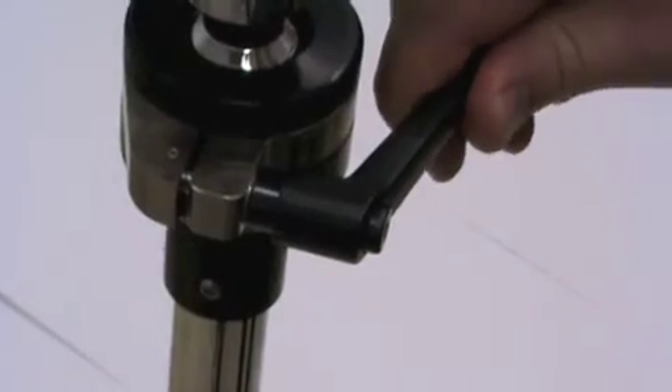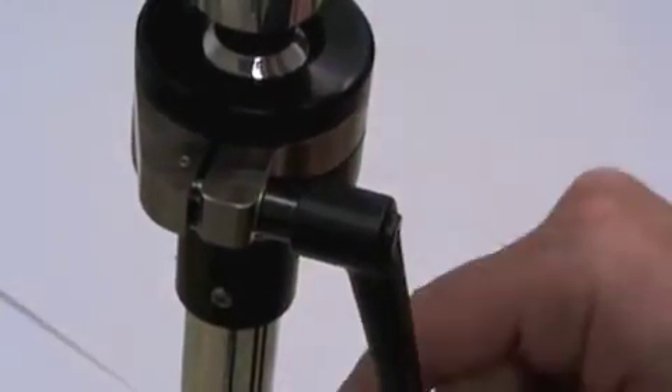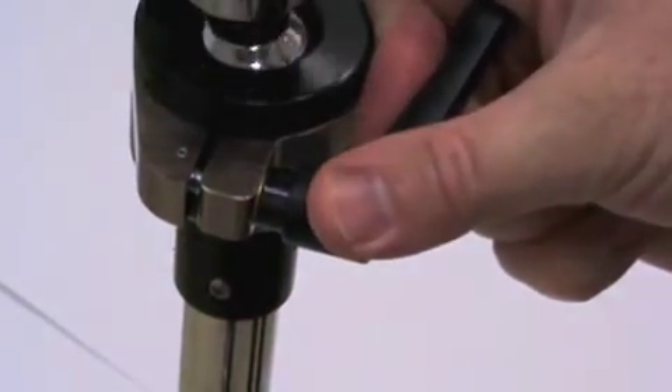To reposition the handle, pull it out, adjust it, let it snap back into place, and then turn the handle to adjust his head.